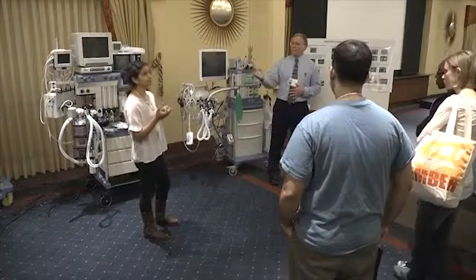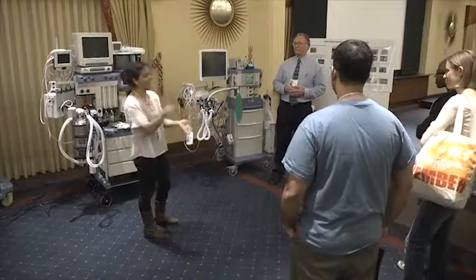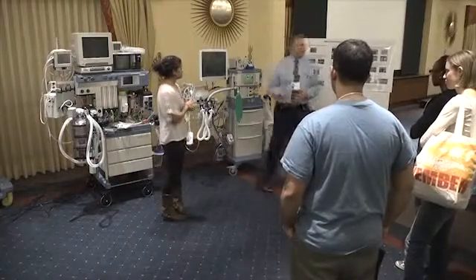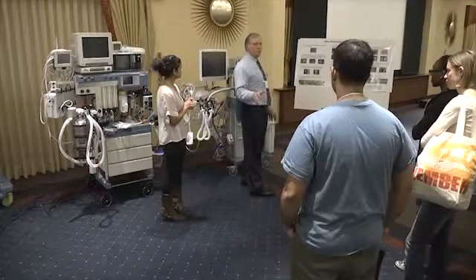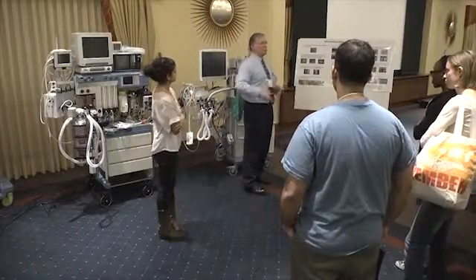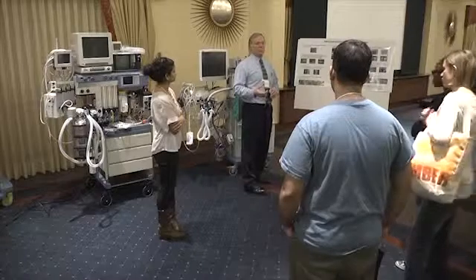But for your boards, you need to know that a full tank is 1,900 to 2,200. You can just remember 2,000 and 660 or 600, something around there. Then you can do whatever calculation they give you. And make sure that you have wall pressure too, looking at your tank pressures. Almost all machines, although there are some exceptions, preferentially draw their gas from the pipeline supply, not the cylinders. So if you turn your cylinders on and you have your pipelines plugged in, it'll preferentially draw from the pipeline supply in almost all cases.